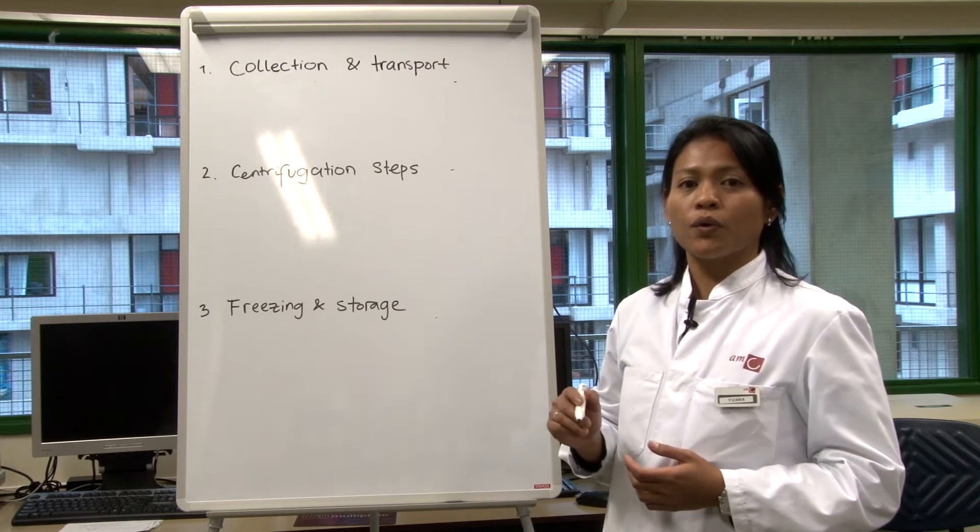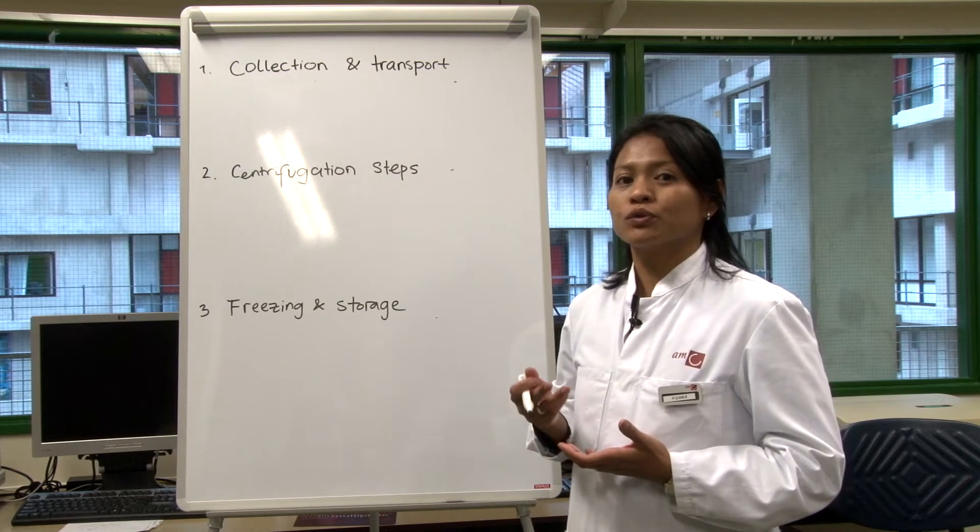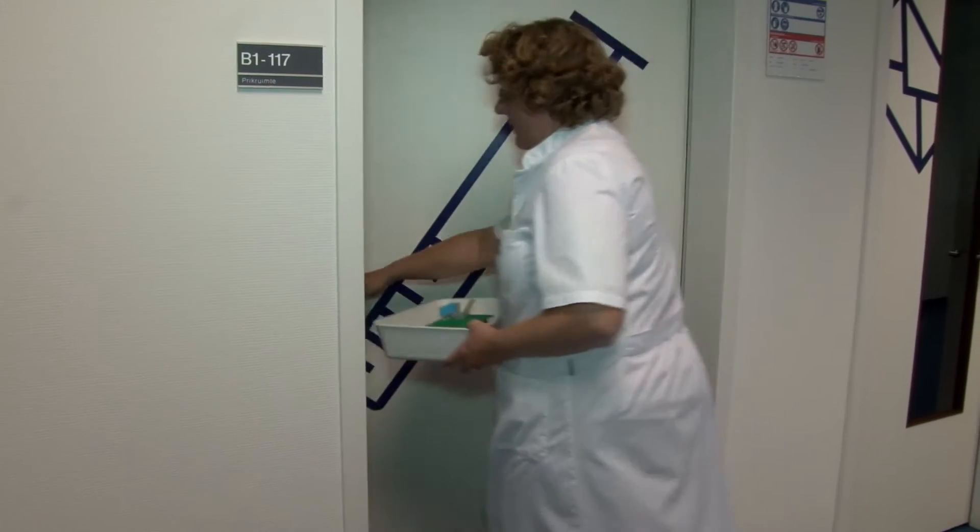In this film, we're going to show how we collect the blood to isolate the plasma, and also how to freeze and store the plasma.